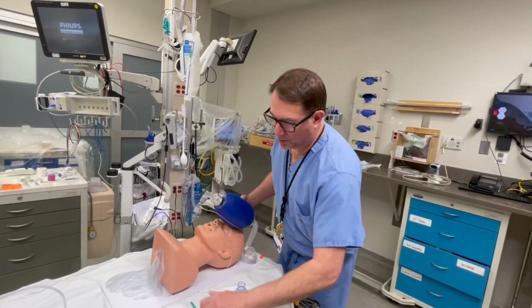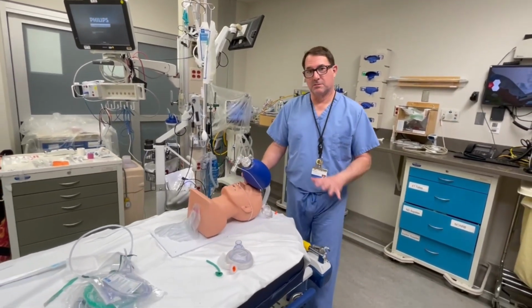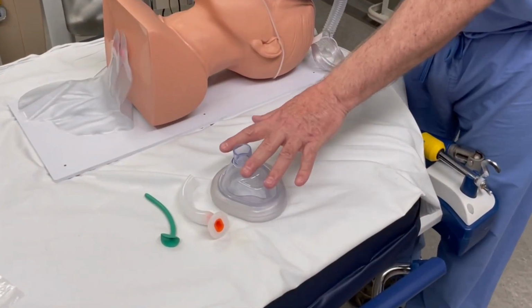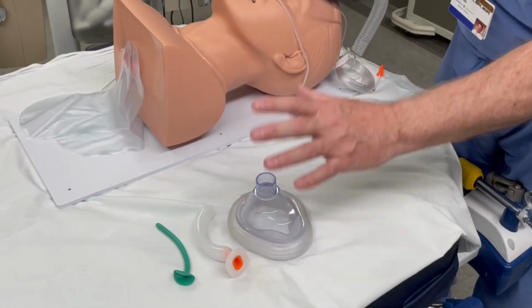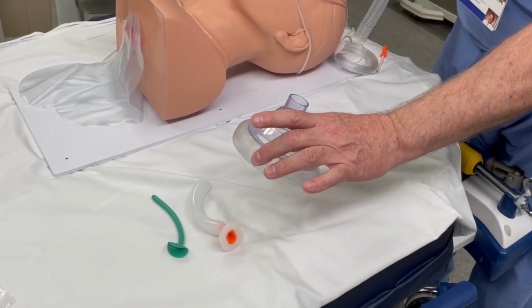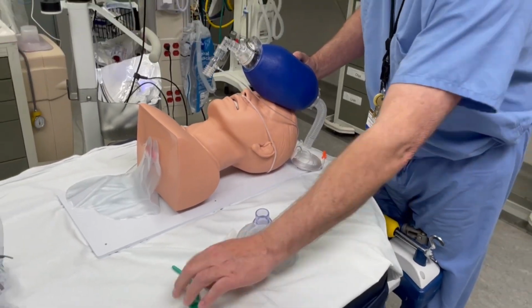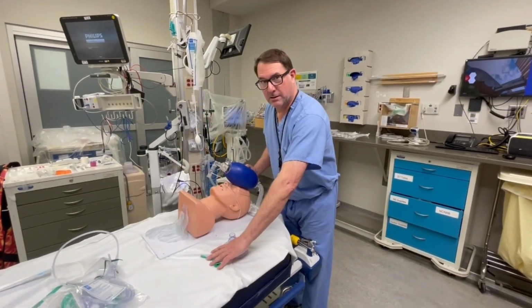So, in summary, these three items right here, the mask, the oral airway, and the nasal airway, I want you to think about as like a seat belt. This and the prongs are like the seat belt in your car. They're there for your safety. The first thing you're going to reach for when you have an unsuccessful intubation attempt is this mask, an oral airway, and a nasal airway. These things need to be close at hand.